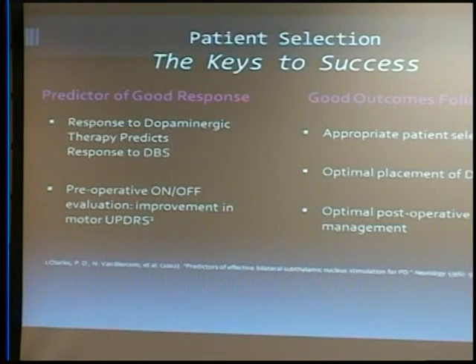And then as far as this surgery being successful, it comes down to really 3 things, as I kind of have already touched on. Selecting an appropriate candidate, getting the lead in the right location, and then post-operatively managing the medications and the stimulation in follow-up visits. Those are the 3 keys.